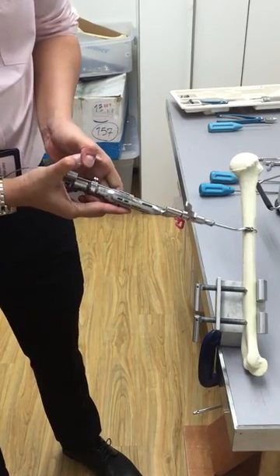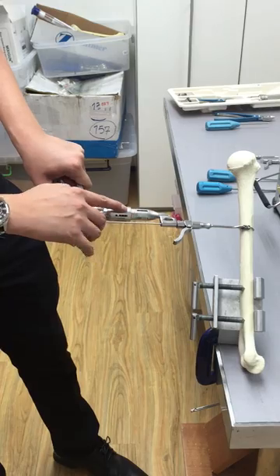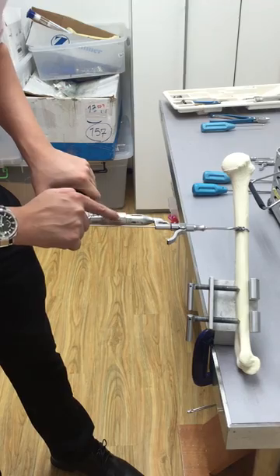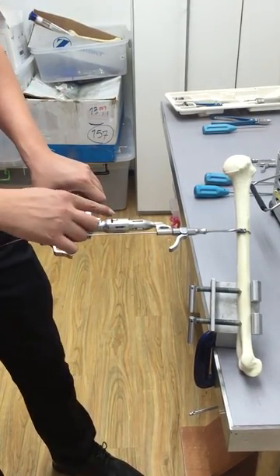Push this down to lock it, and then squeeze on this trigger to tension it. As you squeeze it, you can see the numbers moving from 25 to 50 to 75 and 100. It is recommended to tighten it to between 75 to 100 for each cable that you use.